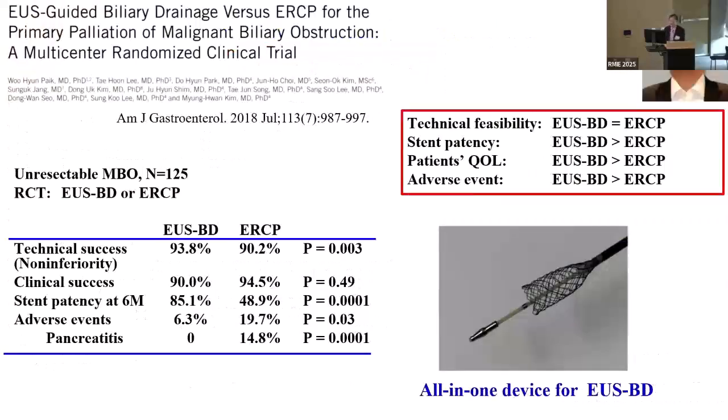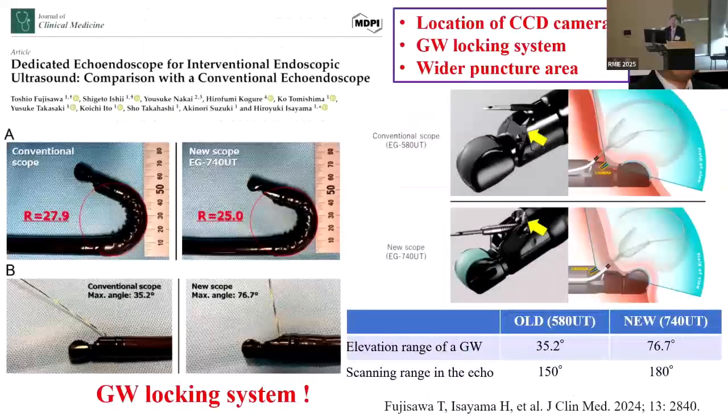This is a Korean study. They used an all-in-one device for the ESBD. From their RCT, the technical feasibility is almost the same, but ESBD is superior in stent patency, patient QOL, and adverse events. So if we have very good equipment, we can perform the ESBD very safely. So I want to introduce some development of the devices.